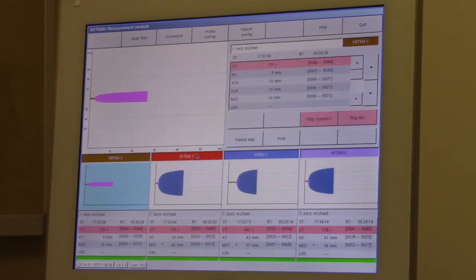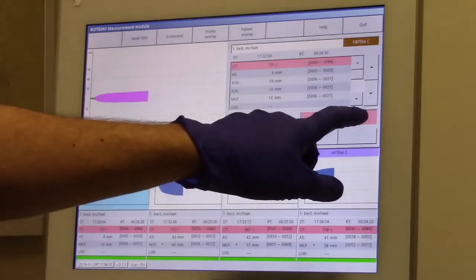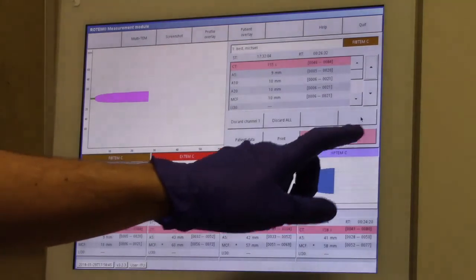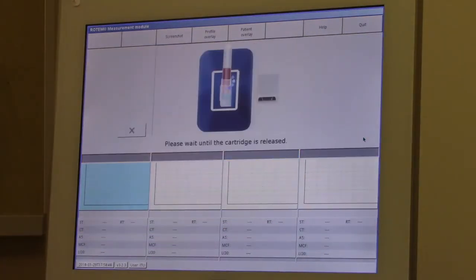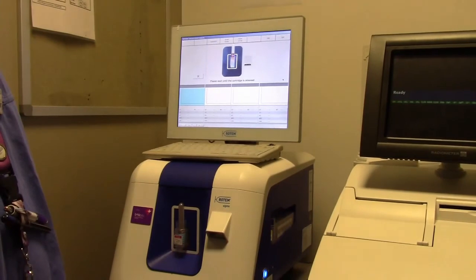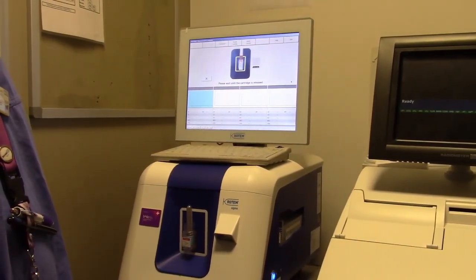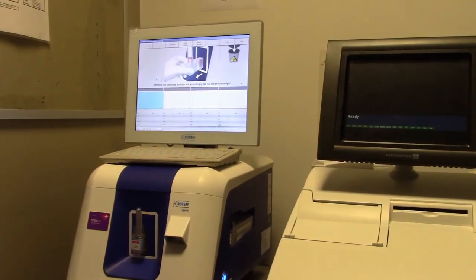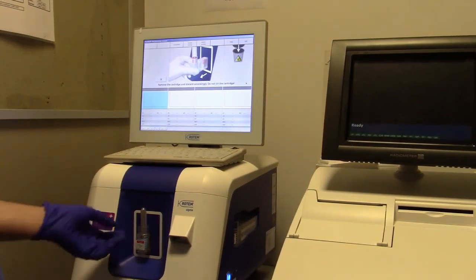Now to stop the analyzer, press stop all. Now press save clear all. This will clear all patient data. Please wait until the cartridge is released — failing to do so may damage the machine. Remove the cartridge and discard accordingly. Do not tilt the cartridge.